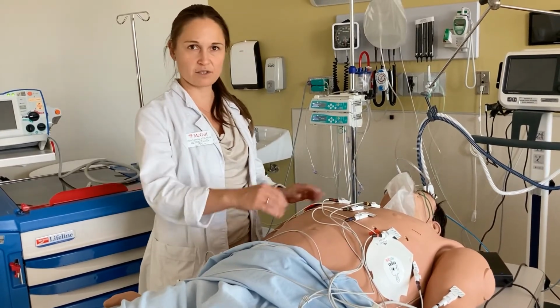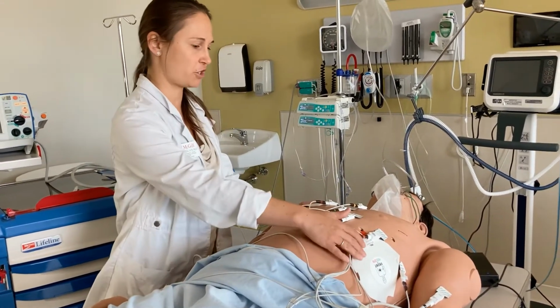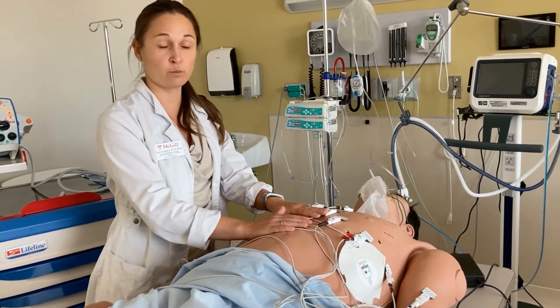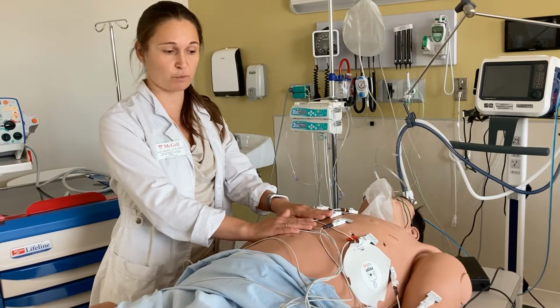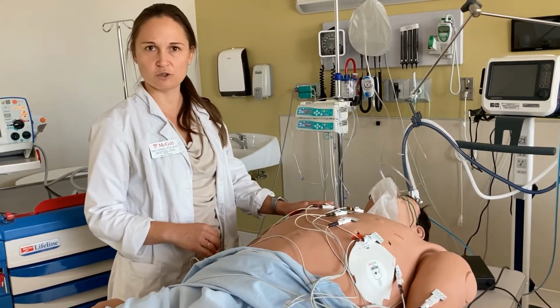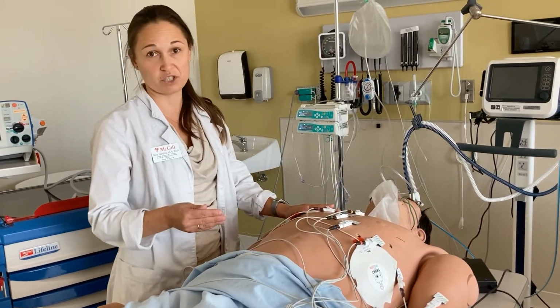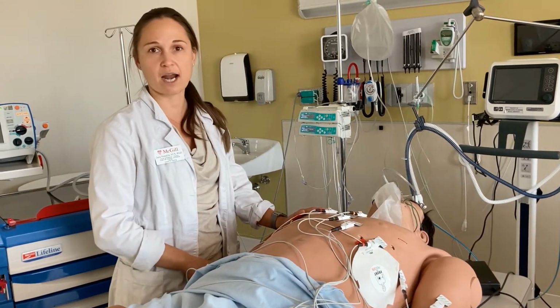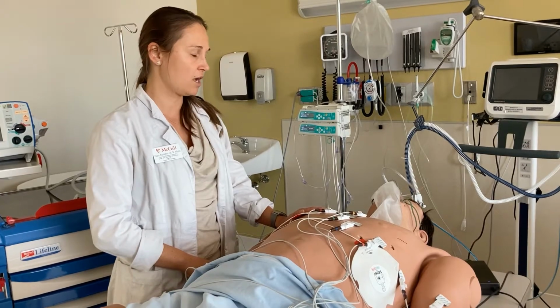So my pads are already applied to the patient. You will also see that my 12-lead EKG is connected. And before I cardiovert the patient, I will make sure that my EKG machine is continuously recording a 12-lead EKG so we can later analyze our intervention.